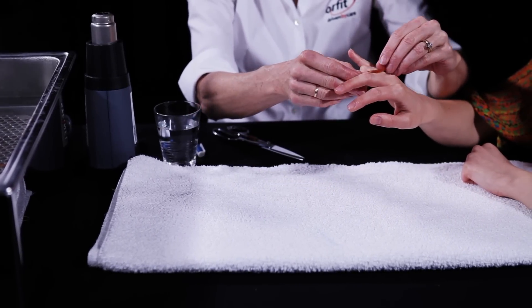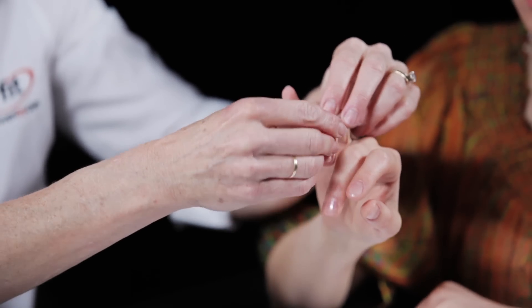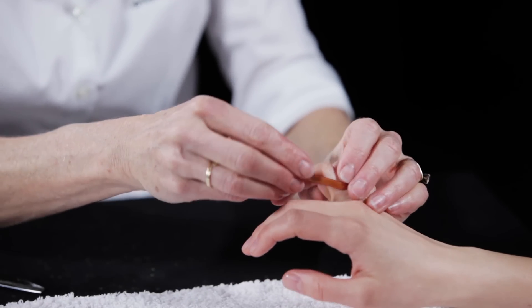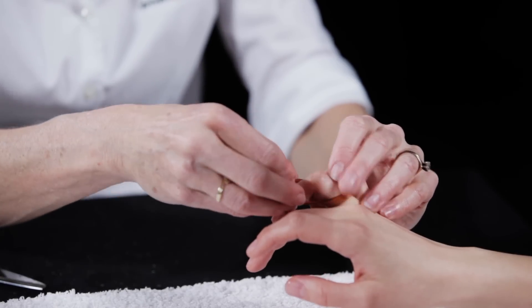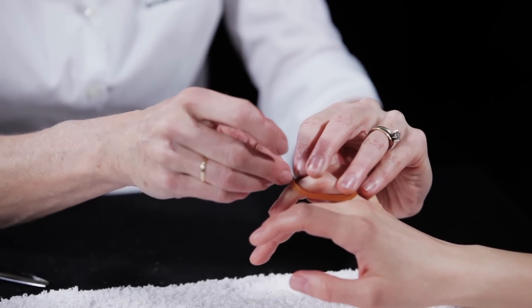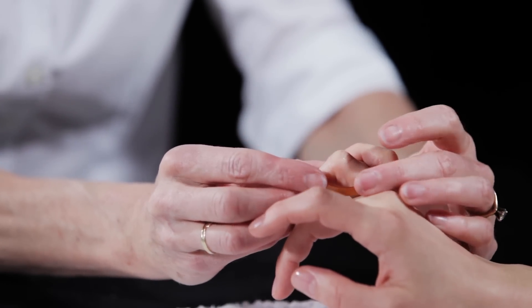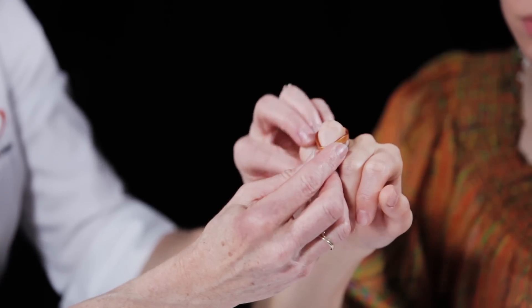Place the middle section of the Orphid strip over the patient's proximal phalanx close to the MCP joint, and stretch both ends of the strip around to cross over the middle phalanx, overlapping the ends in the front close to the DIP joint. This creates an oval shape over the proximal and middle phalanges.